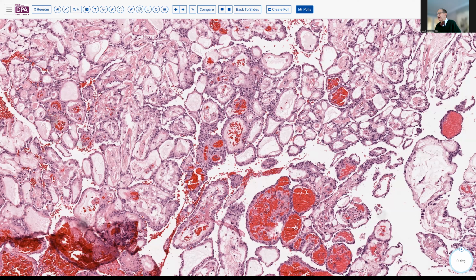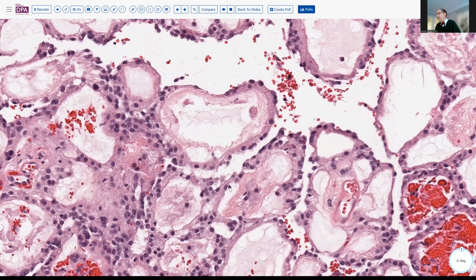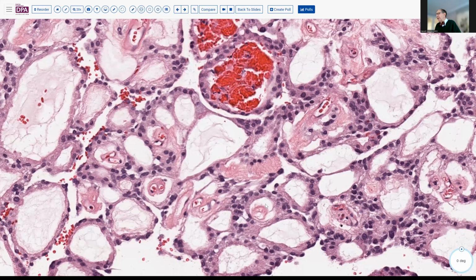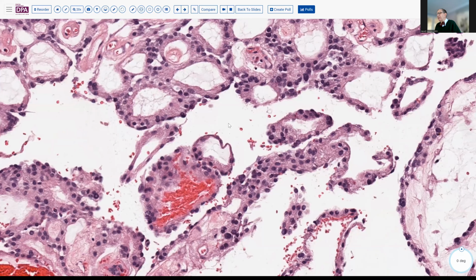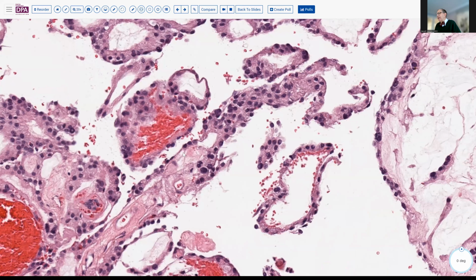Cytologically, as we look at this lesion, you can see that the cytology is fairly low grade, a little bit of pleomorphism, but not much in that direction. And so this is a very interesting lesion. It's not an area where I usually spend very much of my time. So I actually had to borrow this from one of my neurosurgical colleagues who had saved the case. But this is an example of a myxopapillary ependymoma.